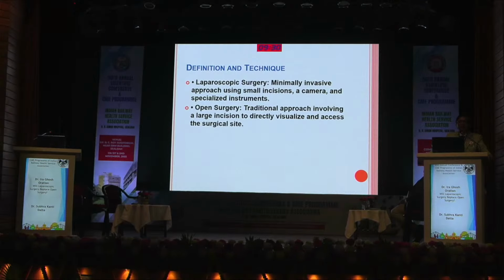And the most important thing that we have not yet been able to overcome in laparoscopic surgery is that in open surgery, we can use our fingers. We can feel the tissues. We can do perfect dissection. And also, as we were told in our student days, the fingers are the best retractors that you have. So those things we cannot use in laparoscopic surgery. One should not forget it.